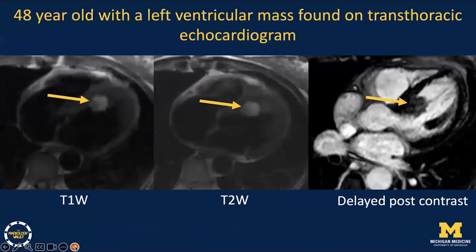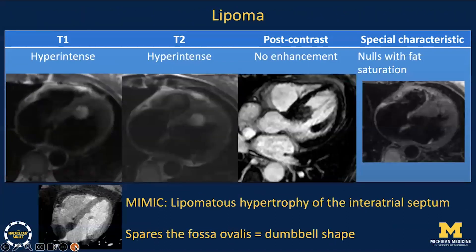This is a 48-year-old with a left ventricular mass on echo. In order to make this diagnosis, a fat saturation sequence is key, as lipomas will null or lose signal with fat saturation. Lipomas are T1 and T2 hyperintense, and they lack appreciable contrast enhancement.